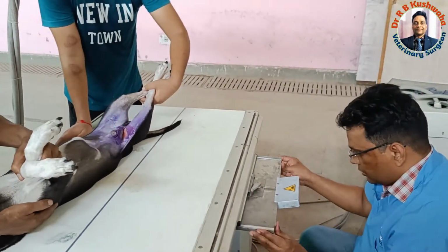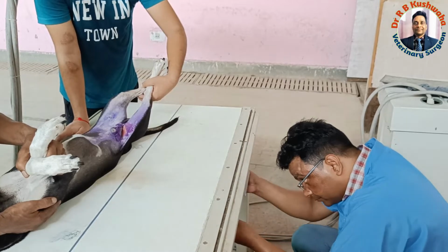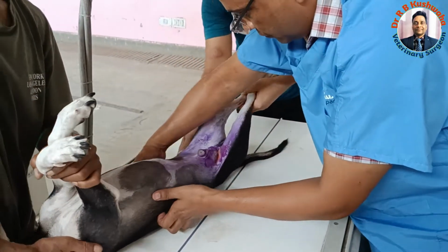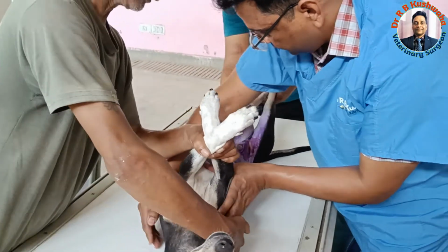Now simply I insert this here. We position the animal like this.